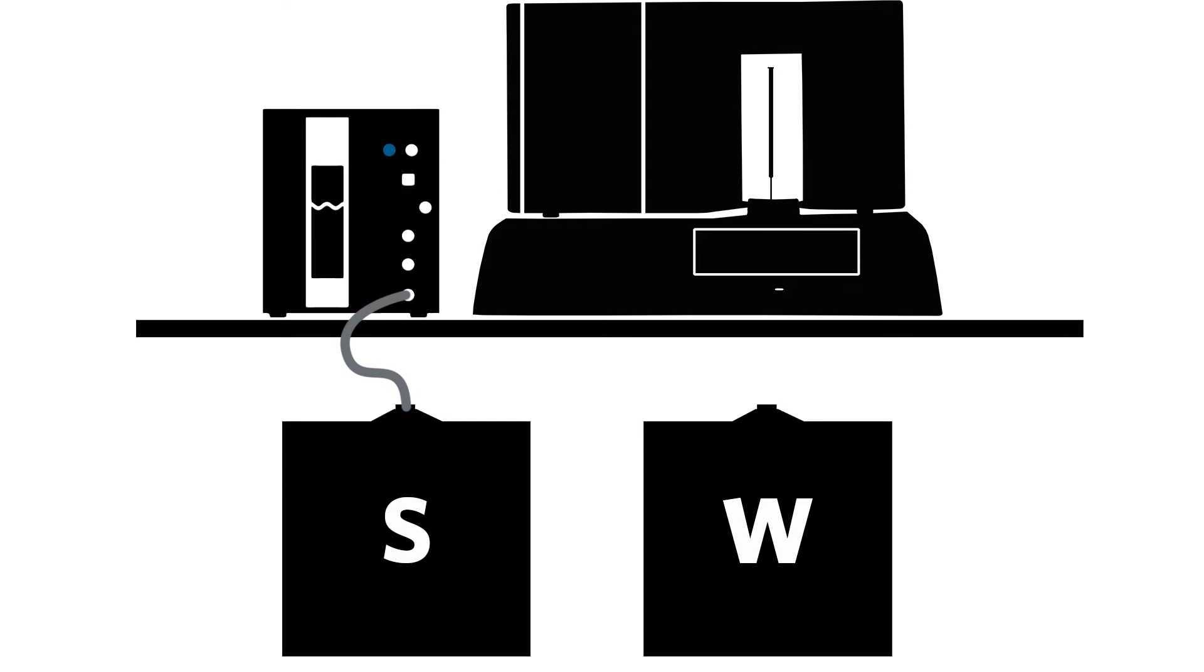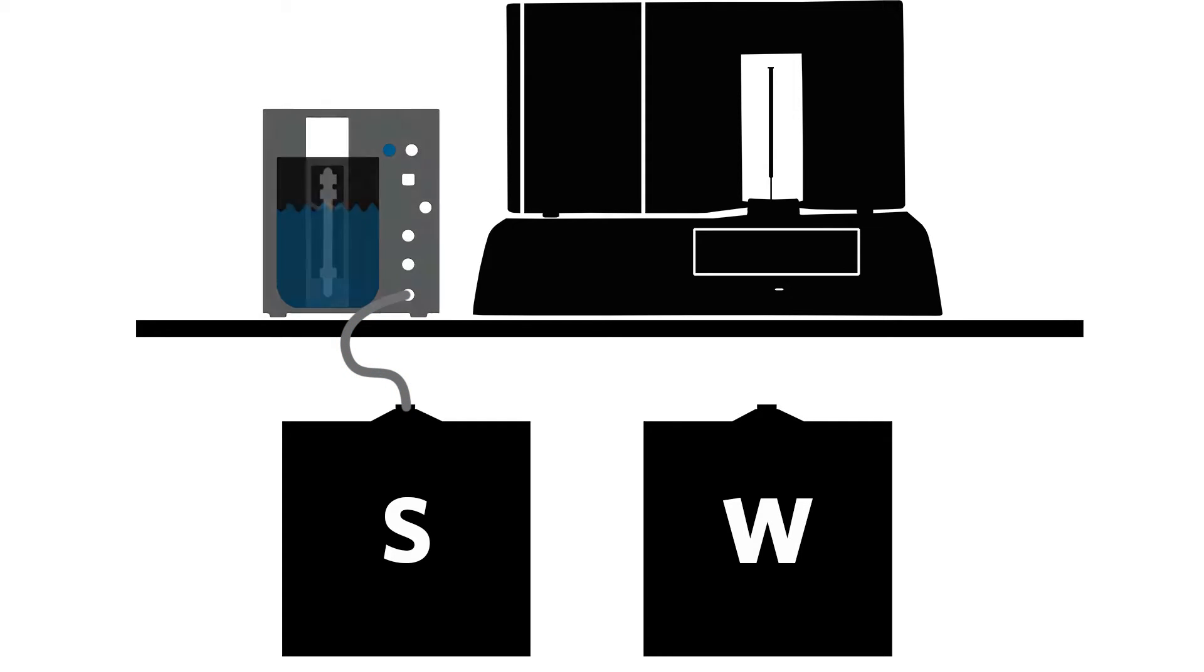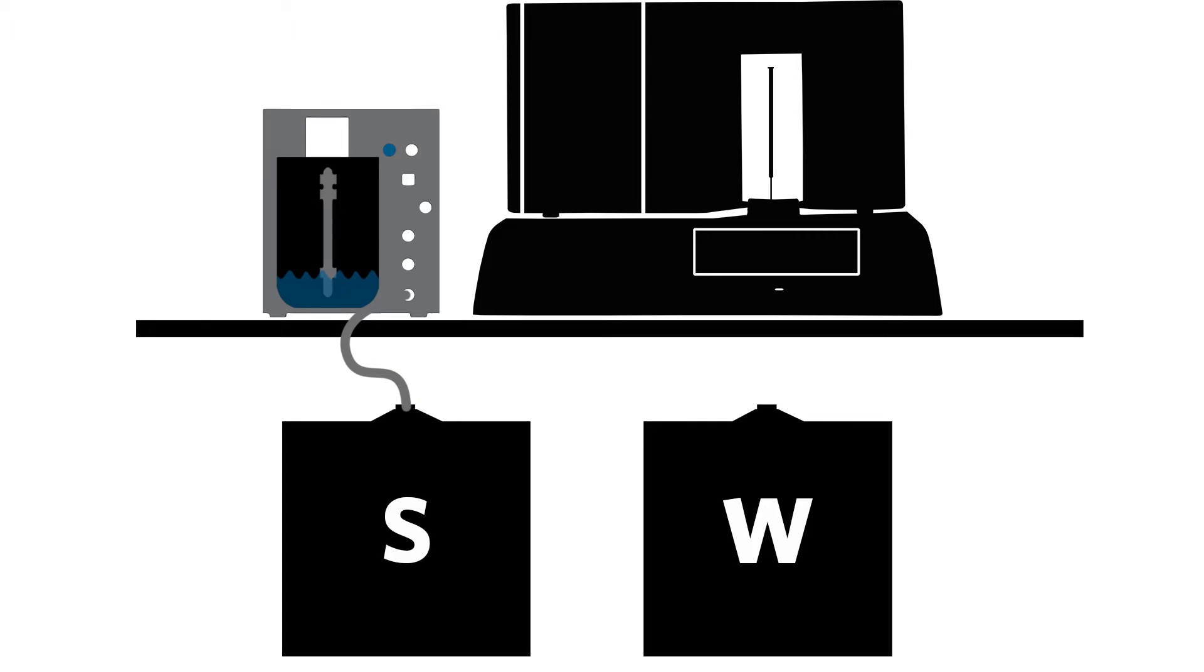If the alarm sounds and beeps slowly, the Sheath Delivery System timed out when attempting to fill and the SDS cannot draw sheath fluid.